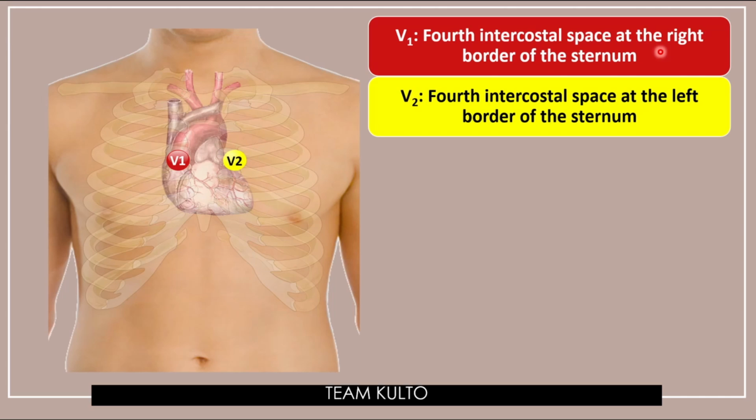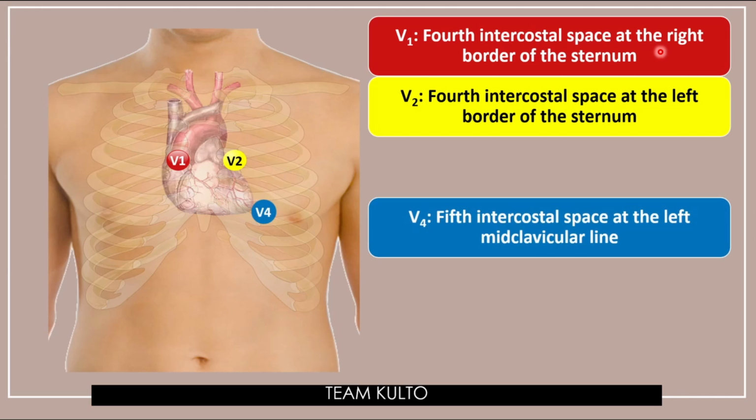Ngayon, syempre ang kasunod, chronological order tayo. Pagtaas ng V2, V3, wrong. Para mas maging madali sa'yo ang gawin mo, ganito. Okay lang naman yun kung kabisado mo na talaga. Ilagay mo na yung V3. Pero kung gusto mo talaga yung mas accurate, ang tamang placing ay uunahin mo yung V4.